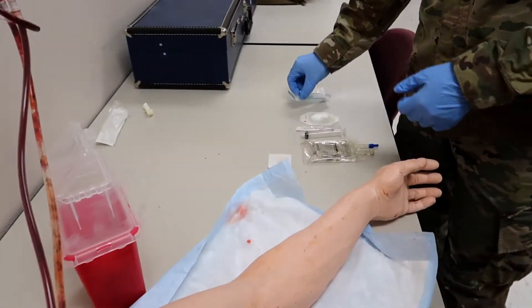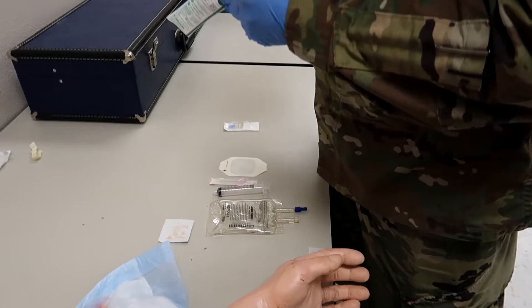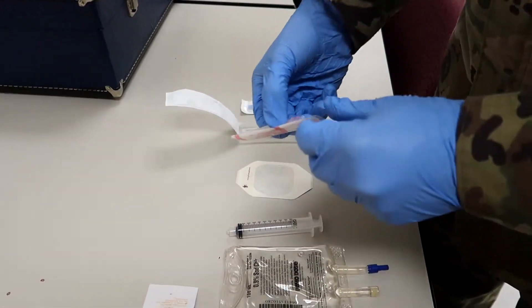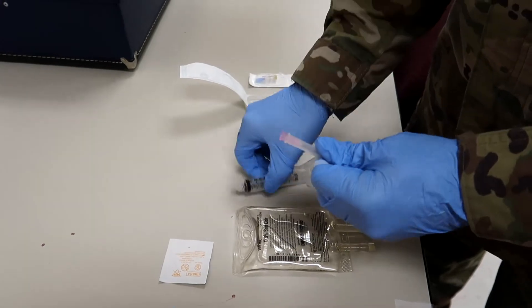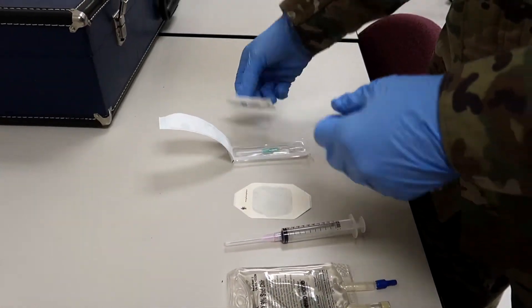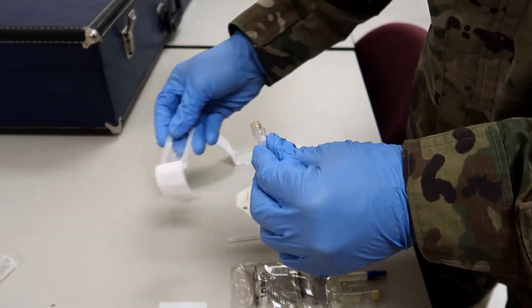Step two is gather, inspect, and prepare your equipment. Really, really take your time on this — don't feel rushed, don't feel like you need to speed it up. This is where you can make the whole assessment go by super fast. Because if you prep your equipment just right, it's literally just picking it up and sticking it in. He's making sure all his equipment is ready, getting his flush prepared for the saline lock. This is really going to save you time if you take time to prepare and get everything available.